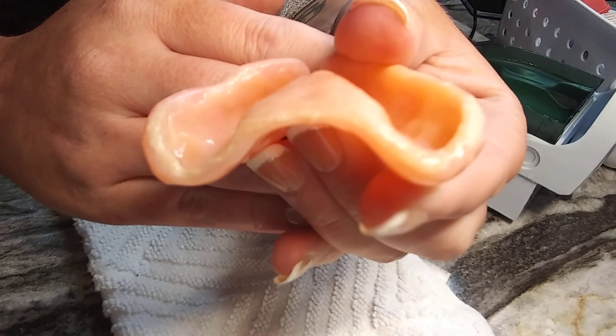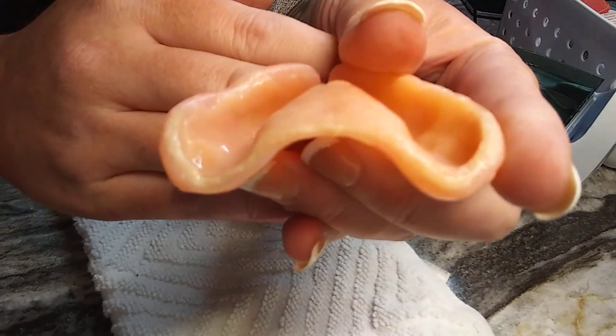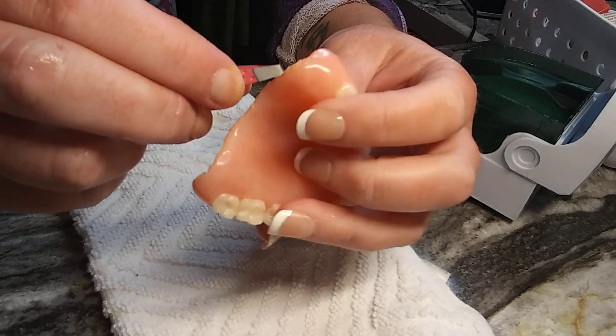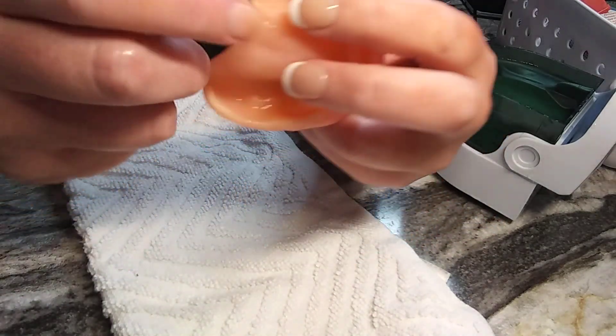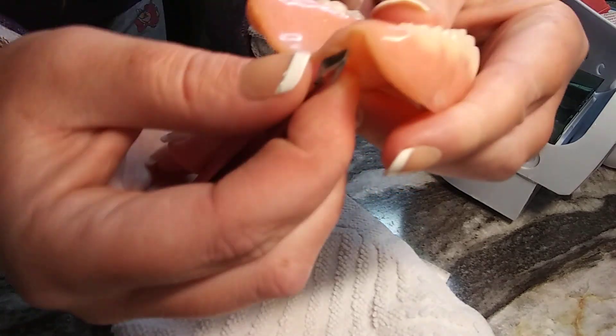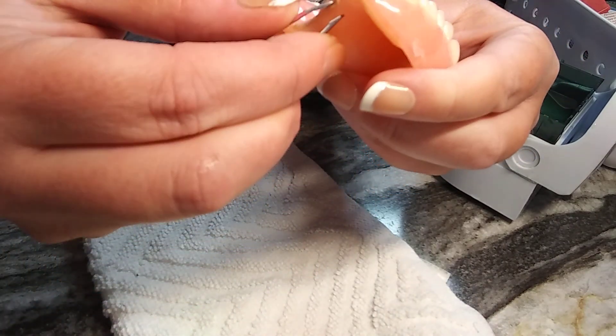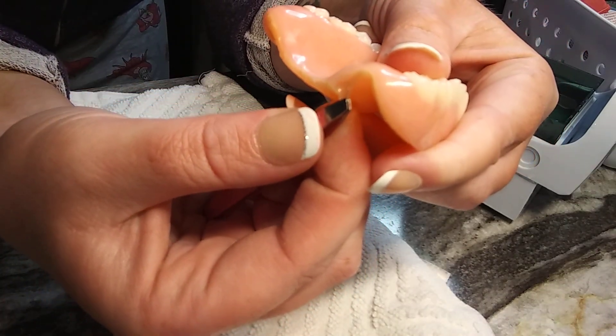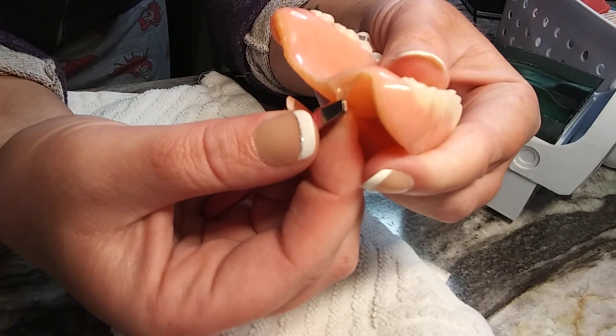Okay, so you can see all this is lifting on this side. This side's way worse — see how I can grab it with the tweezer and I'm pulling it off? That's when you know your reline needs to come out.